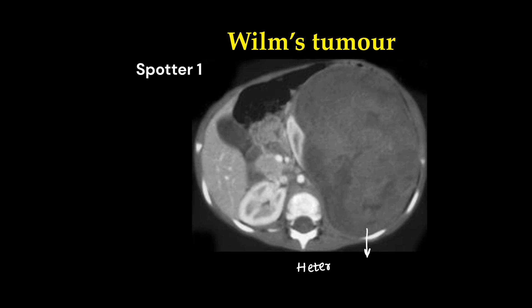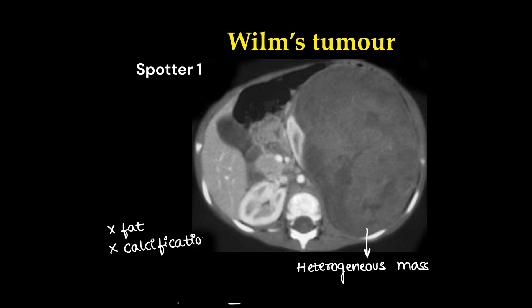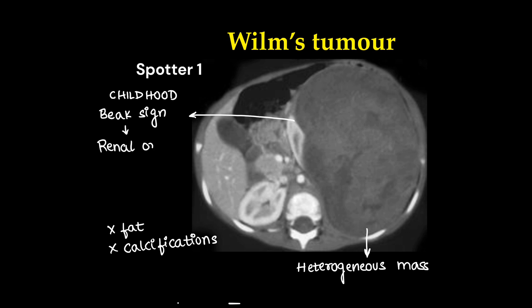This was Wilms tumor. Here we can see a heterogeneously enhancing mass lesion in the abdomen — quite large. There is no fat or calcification within the mass. This is one of the childhood tumors, and it shows the beak sign with the kidney, indicating it is of renal origin.